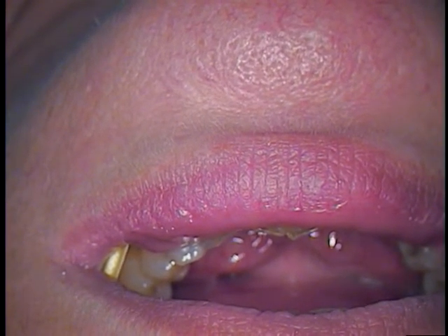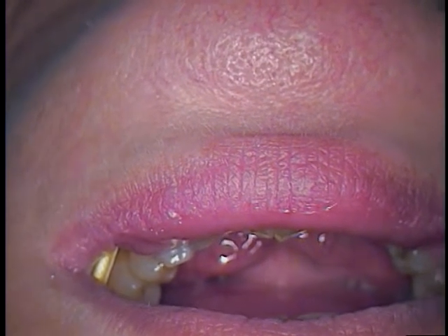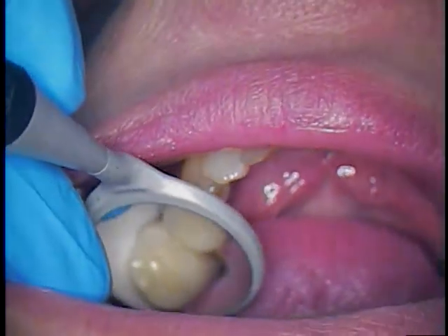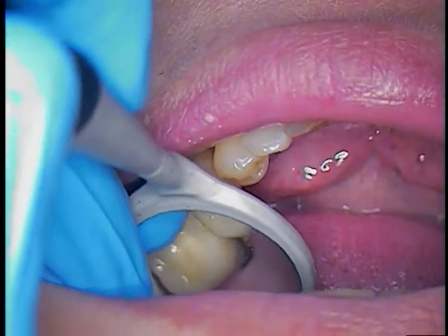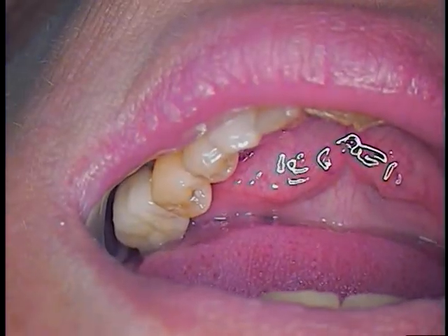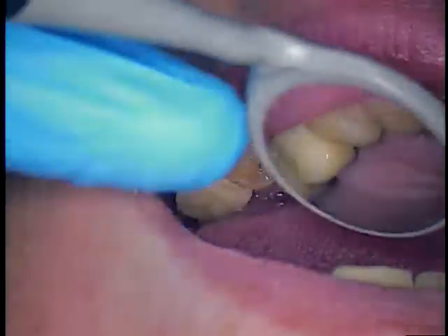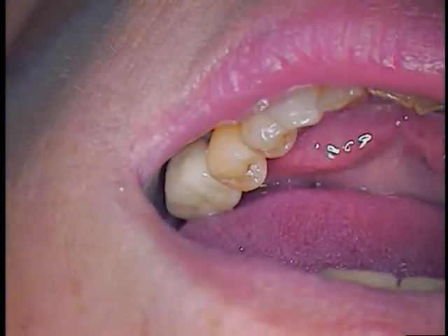I'm here with my patient who's come in with a dental implant crown. This is a cemented crown on number 14. It is not a screw retained, but there is a screwed abutment, and the abutment screw is loose, and we would like to go ahead and have that serviced. We are going to change out the abutment screw.